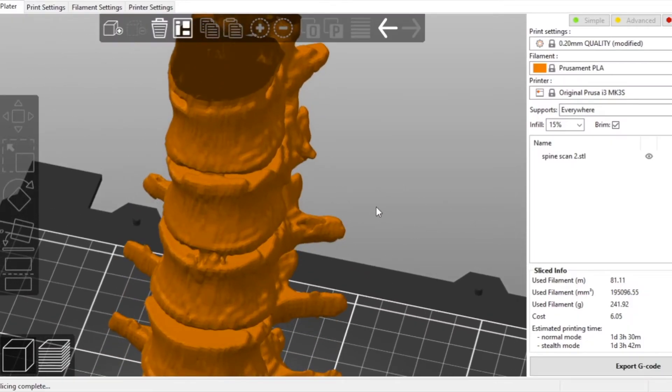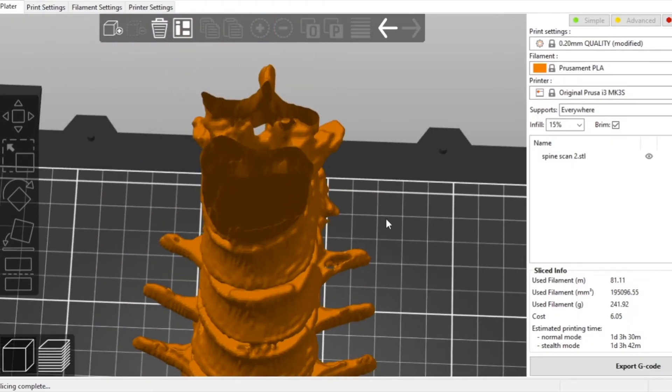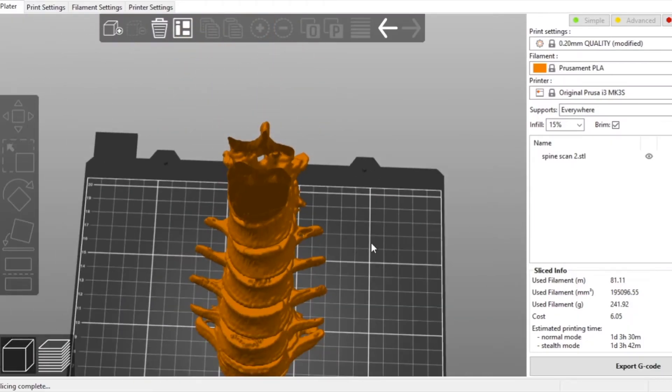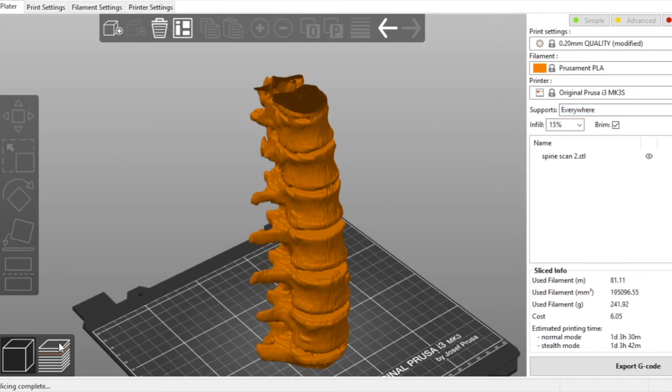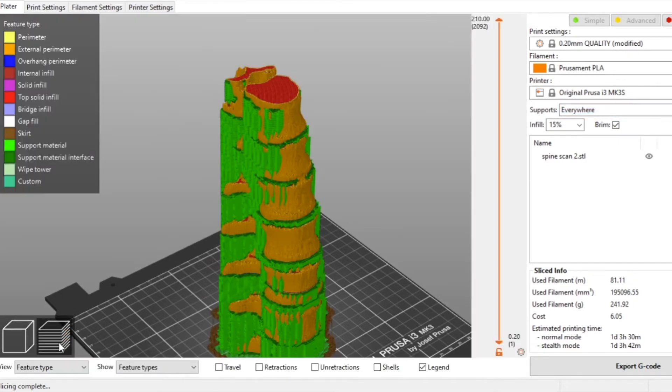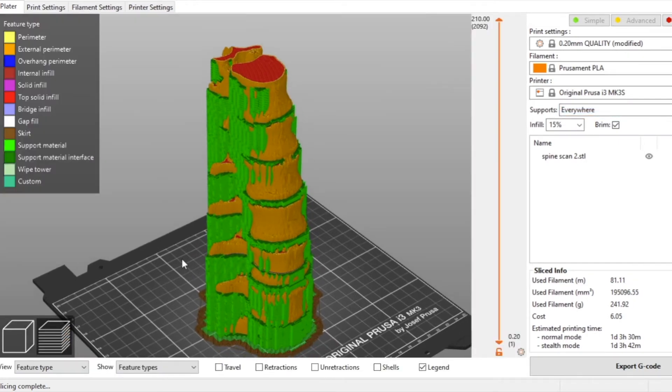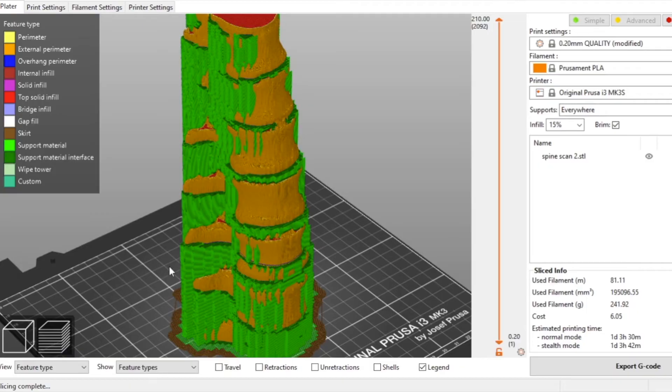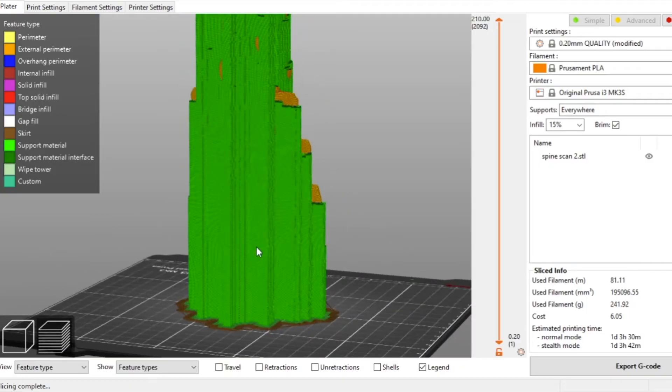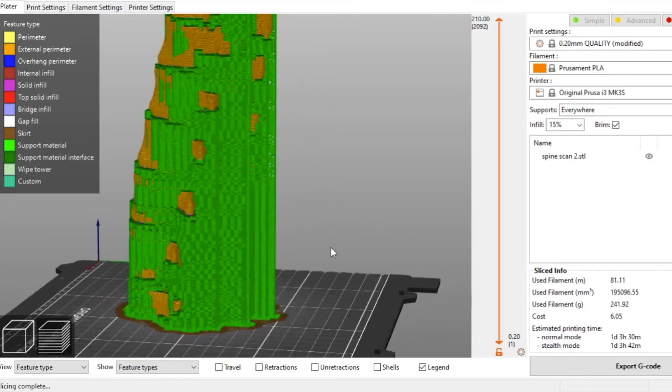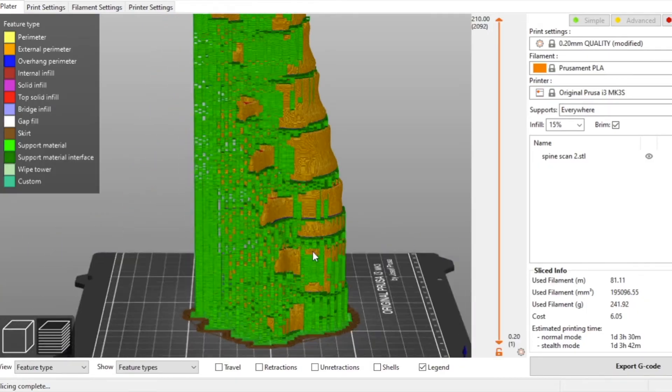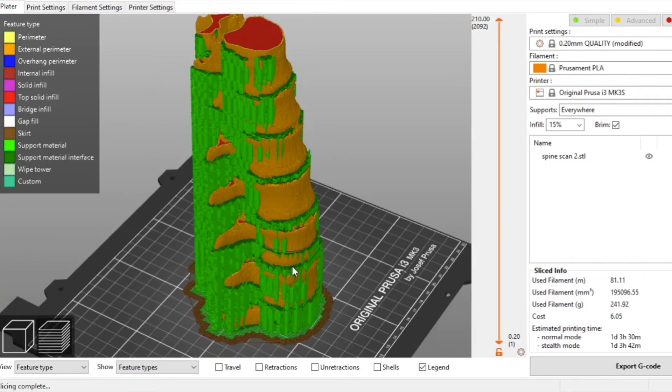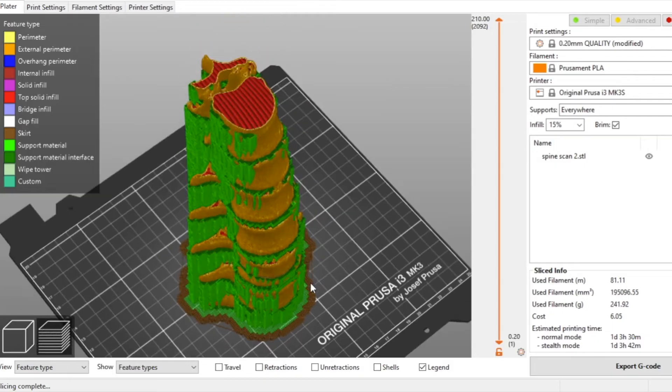With our model complete I've imported it into our slicing program, in this case PrusaSlicer, to be printed out on a Prusa 3D printer. Due to the intricate and organic geometry of this model it's going to generate quite a bit of support material which we're going to remove after the printing is complete.